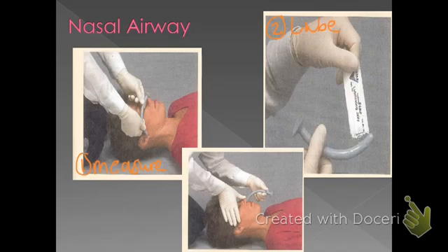And what you don't see here is that there's a beveled portion to this airway, or a part of the airway that actually has a little bit of a hole. So we want to insert the airway with this side, the beveled portion, going towards the inner septum or towards the inner nose. And again, we need to measure to make sure that it's just perfect. In head injured victims, we do not want to insert a nasal airway, and the key to success with insertion of a nasal airway truly is the lubing of it, because then it just slides right into the nasal cavity.